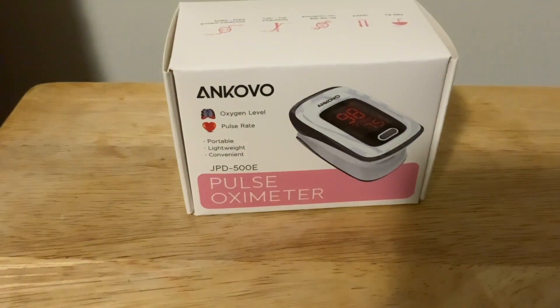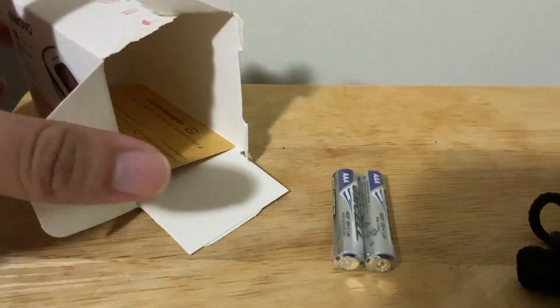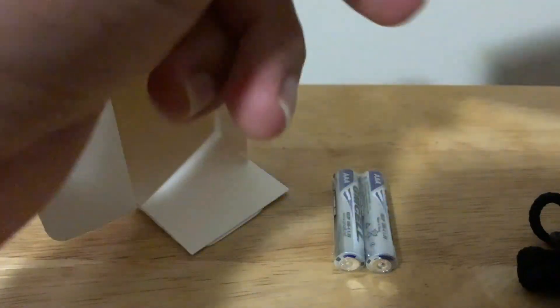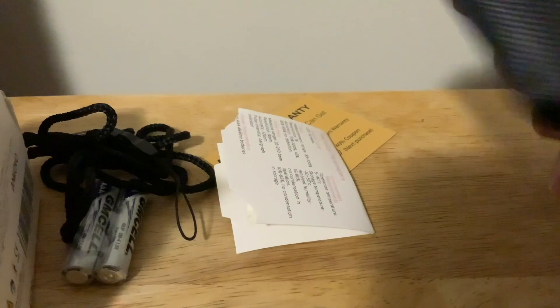Let's check it out. Let's open it up. You guys should probably open this up better than I did. It comes with a pack of batteries, a warranty, the loop, and the little case here.